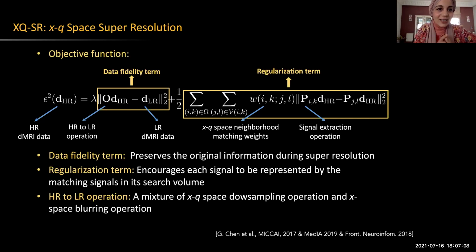However, as I can see here, the title is super resolution, right? So the idea is that what you input to your algorithm is a low resolution image, and what you get as output is a high quality image. So can you connect these two? Can you clarify a little bit how you're actually solving an inverse problem?